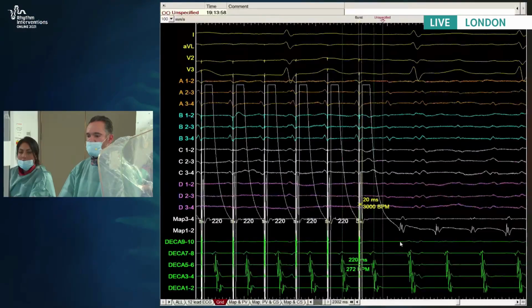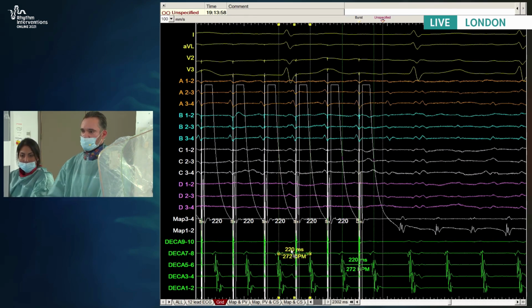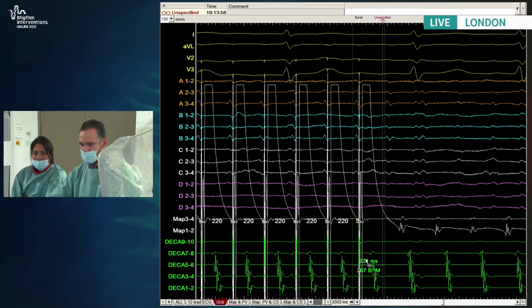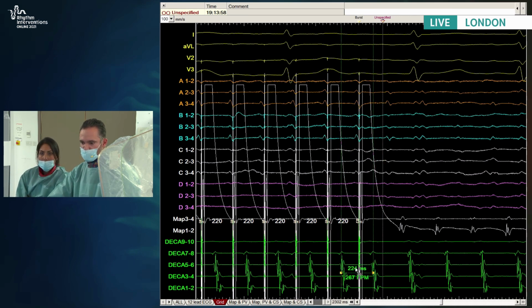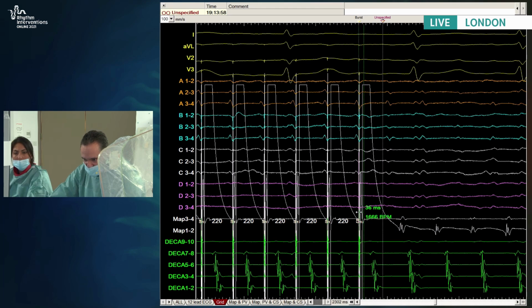So you can see that's accelerated from the CS electrograms. Do you want to measure that again for us in real time so the guys can see for us? So they're moving the calipers along to show that we've entrained. We're pacing at 220, then measuring the return cycle length there, and then carrying that back onto the return cycle length. And we thought 20, 30 odd.